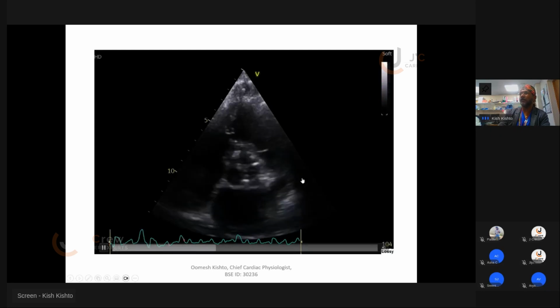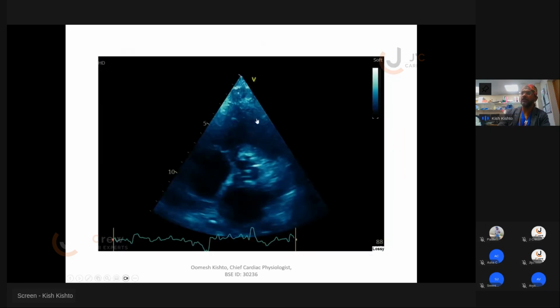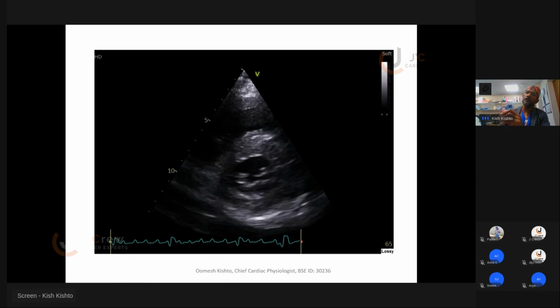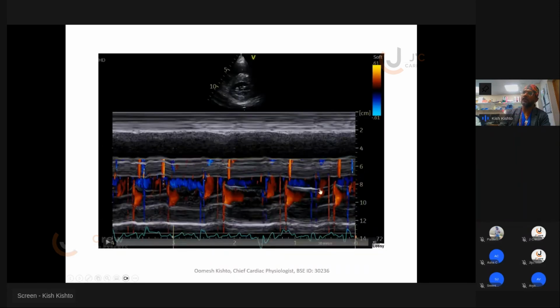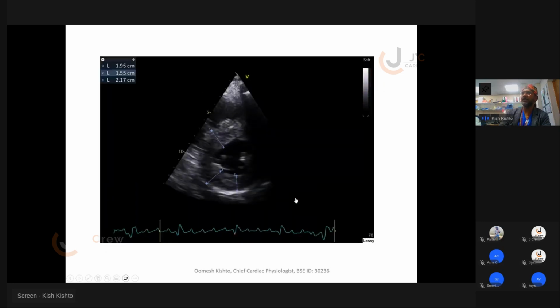Okay, look at this. Again, I tend to double measure it for some reason. That's good. And okay, so now we are up to our short axis view at the mitral valve. So let's have a look at this, and you can see how chunky the wall is there. And I think I did measure it. There you go. The septum, inferolateral wall there.